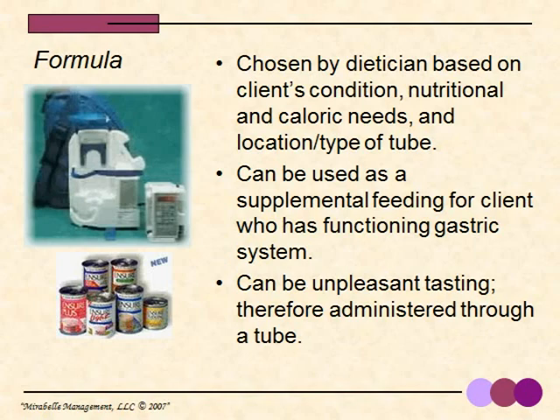Regardless of the type of tube, the liquid nutrition is usually referred to as a formula. The formula is chosen by a dietitian based on the client's condition, the nutritional needs, the caloric needs, and the location and type of tube that is being used.